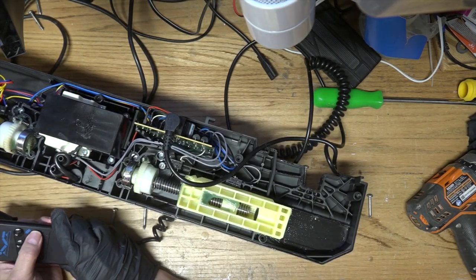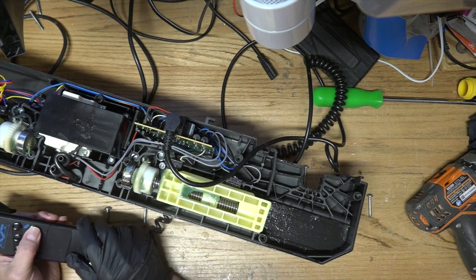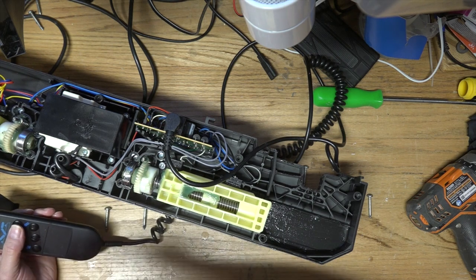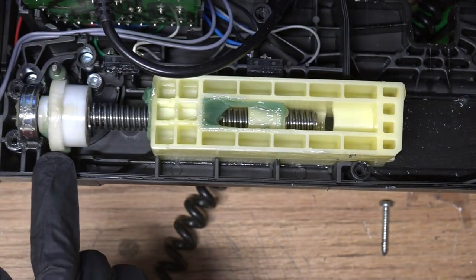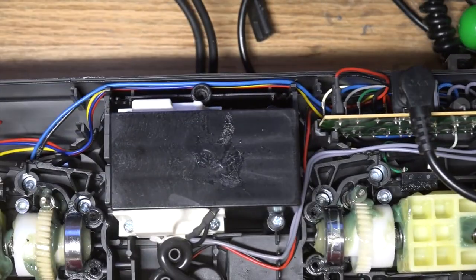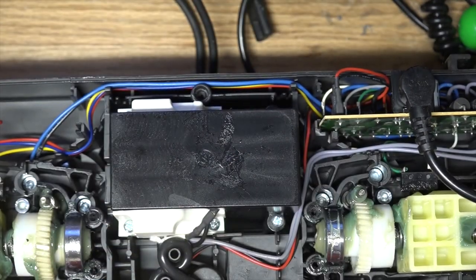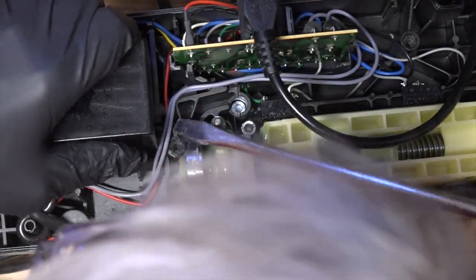Right, let's take this and maybe set it aside for a moment. Okay, now it should work. Yeah, look at that. I'm surprised that works as well as it does with half the supports off. So there's a motor behind with a worm gear right there engaging this guy. And then there's a lead screw that threads into this block here and gets driven back and forth. This area right here, it seems like it's got this plastic block here. Got two screws there. We can take those out first and see what's under there. I don't see any wires going to it, but it goes deep inside there. There's no connections on the back side. I wonder what it's hiding.